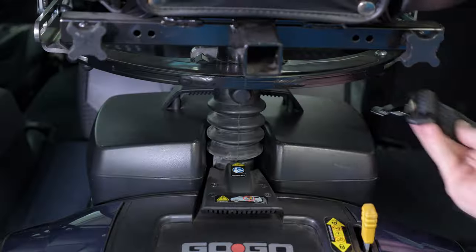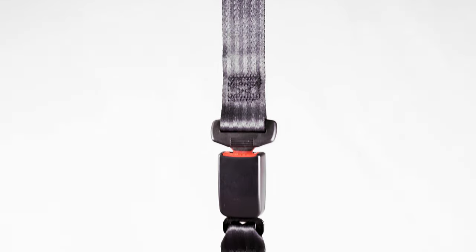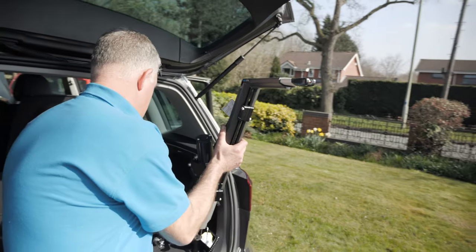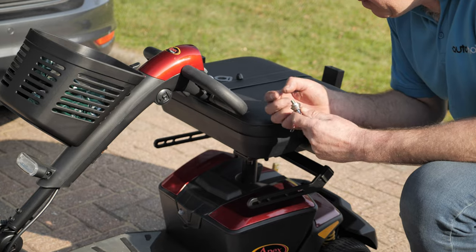Our boot hoists are best complemented by a boot restraint to secure your device in the event of an emergency stop. For more information about boot hoists, wheelchair storage and other vehicle adaptations, speak to one of our experts by web chat, online inquiry or by phone.